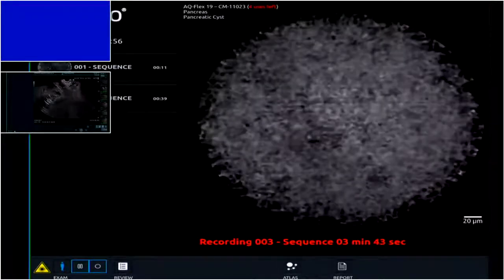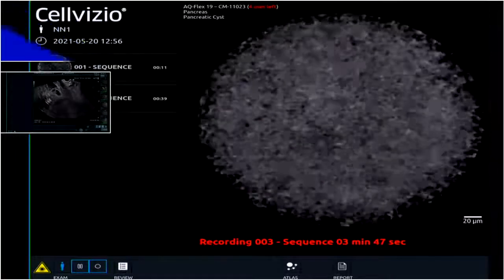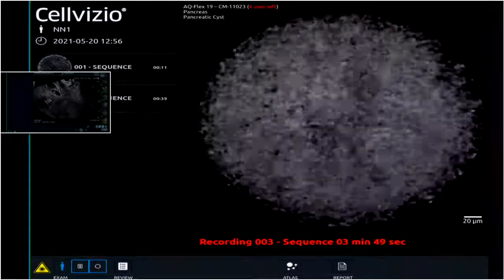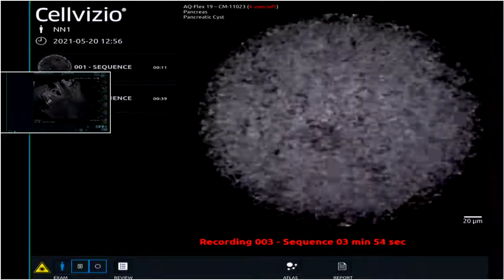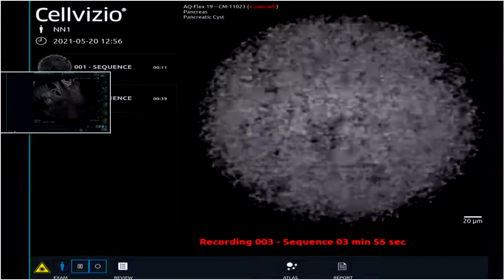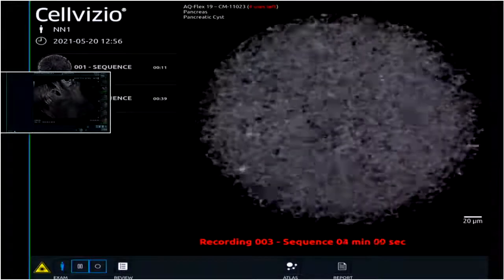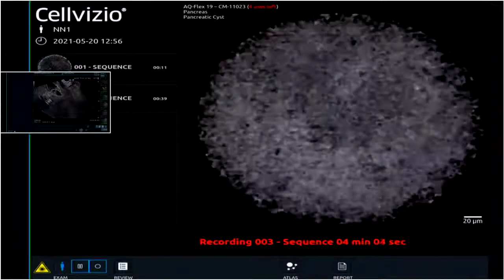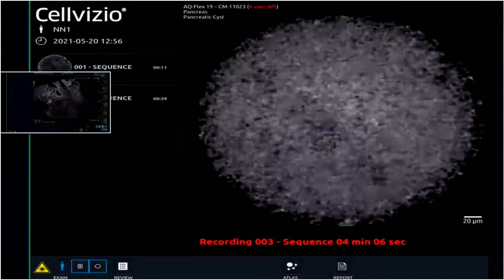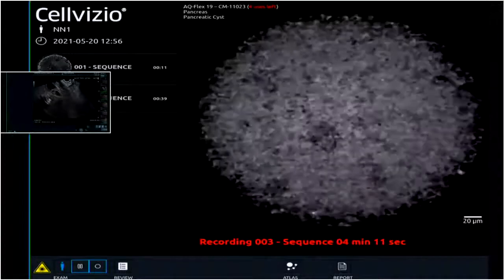The first is to evaluate everything, in spite of this patient has been sent as a pancreatic mass in theory. So we saw a lot of microlithiasis in the biliary tract, and then a history of abdominal pain.